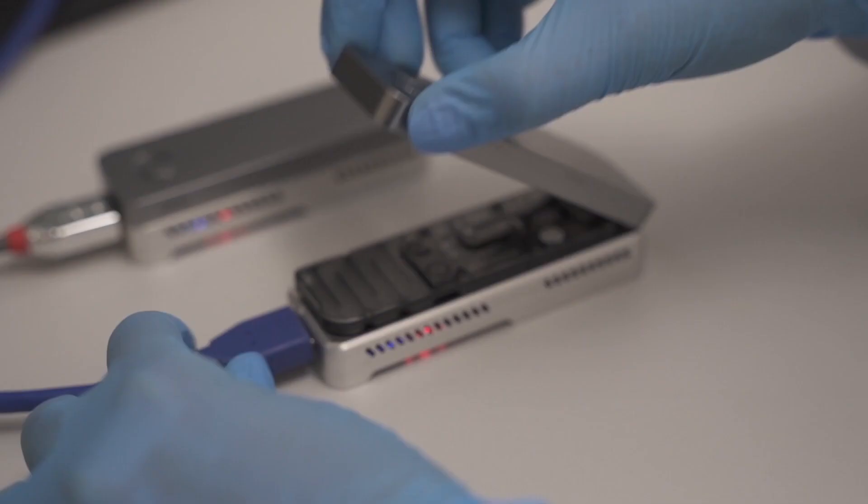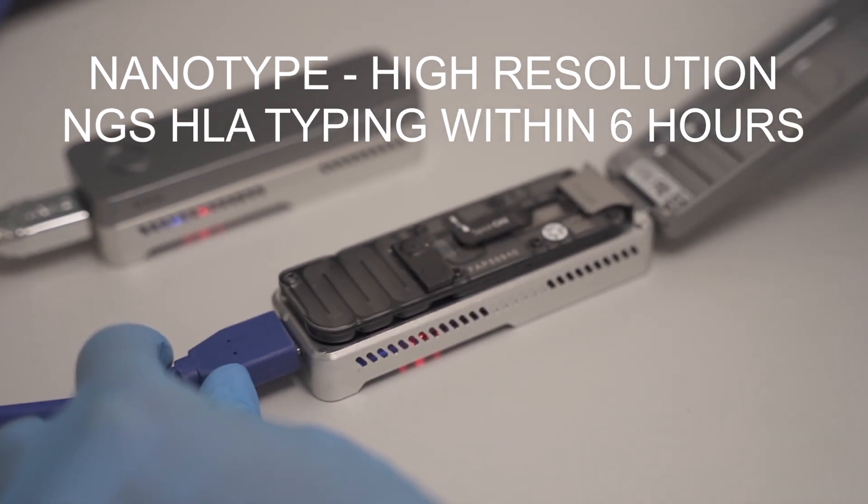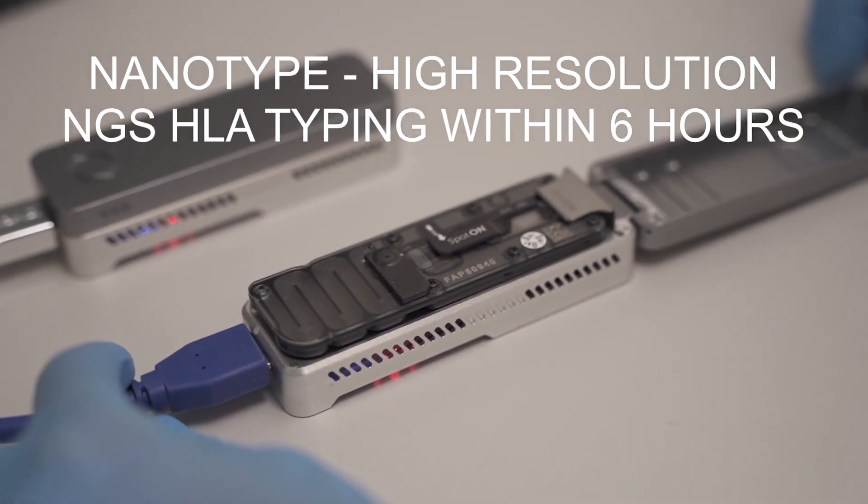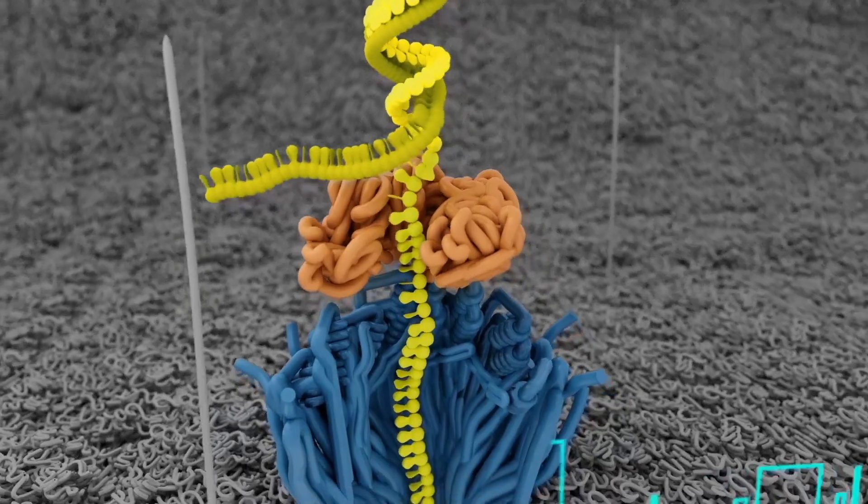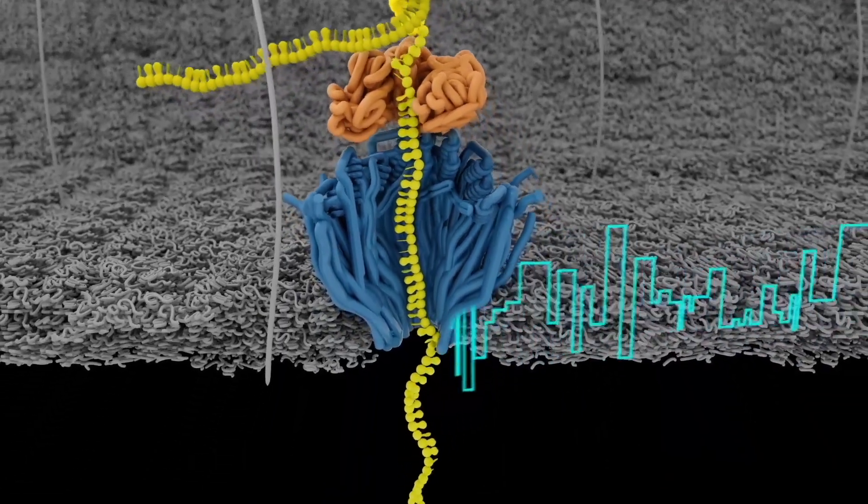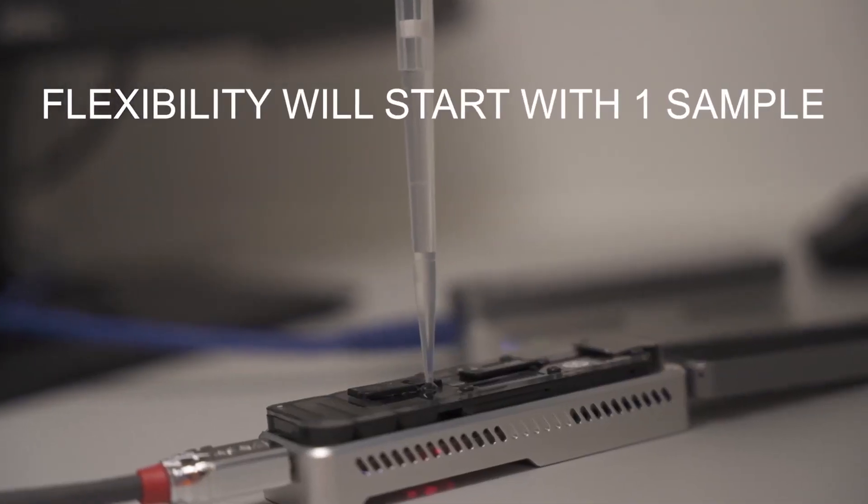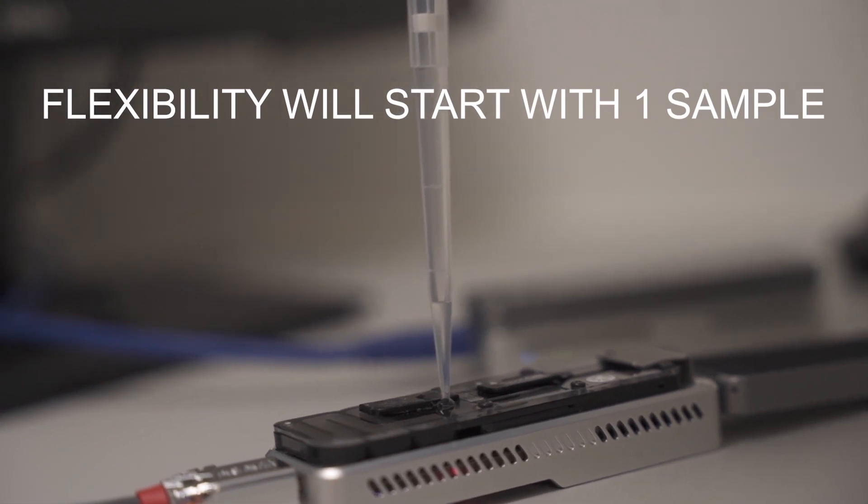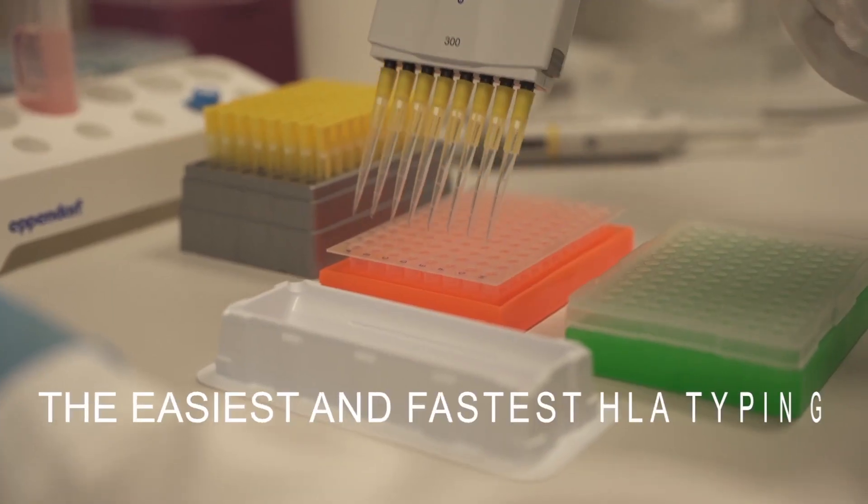Omixon has developed NanoType, the first high-resolution HLA typing method that can be completed in under six hours. Due to the sequencing of larger fragments of DNA, NanoType enables phasing of long-distance polymorphism resulting in unambiguous high-resolution HLA typing.